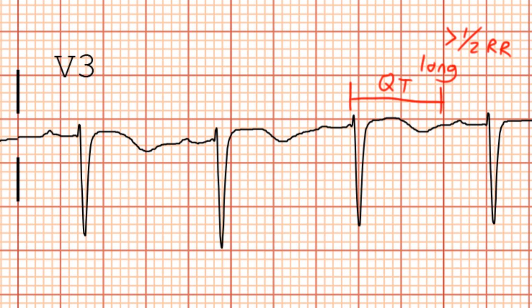Remember that a number of things can cause QT prolongation. In this case, this patient had an acute saddle pulmonary embolism that likely contributed to the QT prolongation and some of these T wave abnormalities that we can see here.